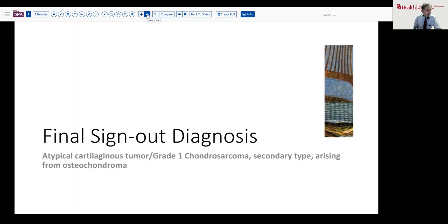So there we have our final sign-out diagnosis: atypical cartilaginous tumor, grade one chondrosarcoma of the secondary type, arising from osteochondroma.